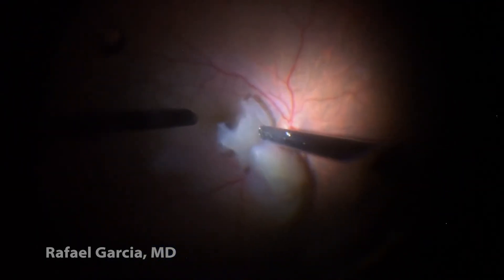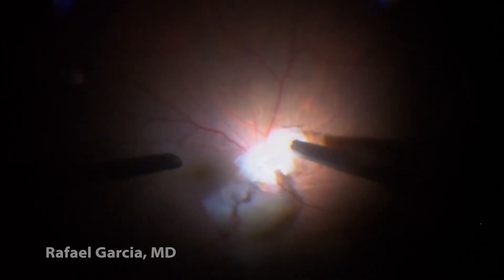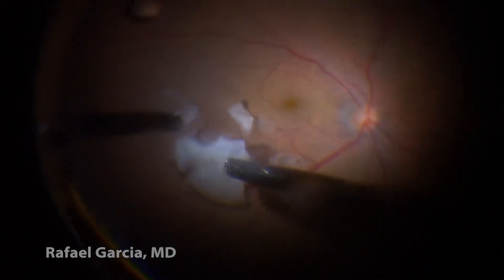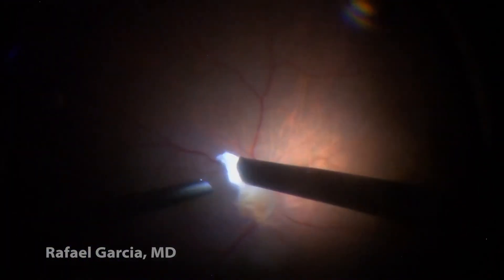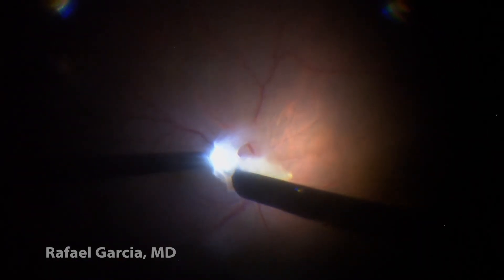The light probe in the left hand can also help in these maneuvers. Perfluorocarbon liquid can also be injected in the vitreous cavity to protect the macula if needed. The downside of the fragmentome is that it is a 20-gauge instrument, so it requires an enlargement of the sclerotomy to be inserted in the eye. However, it surely does its job in performing an efficient and safe lensectomy after a complication of cataract surgery.